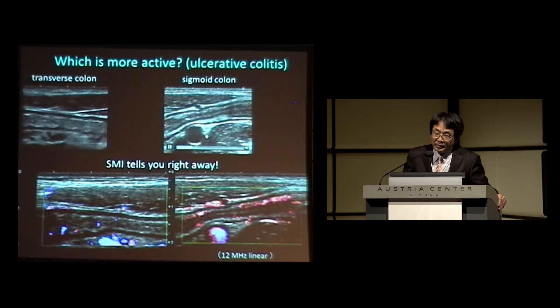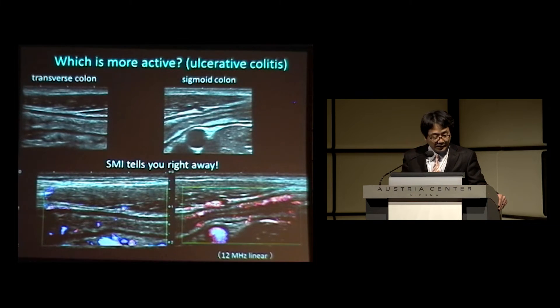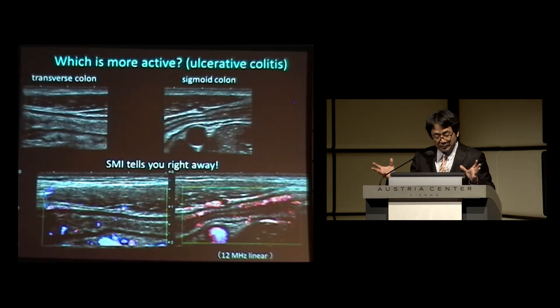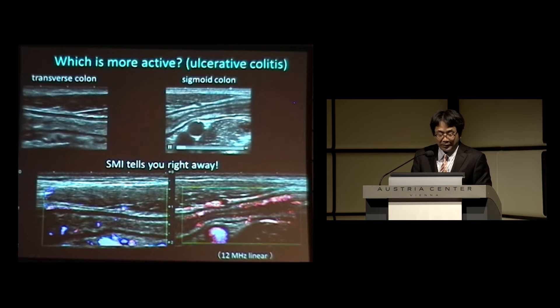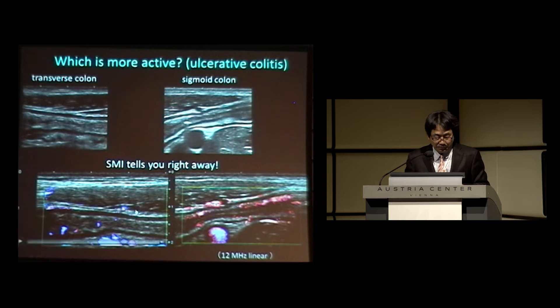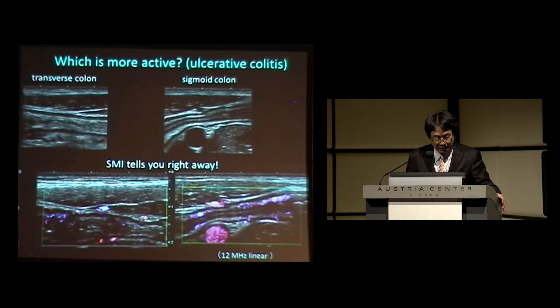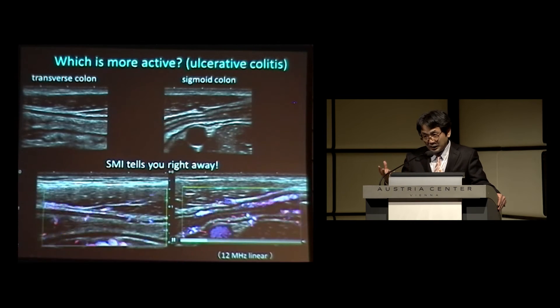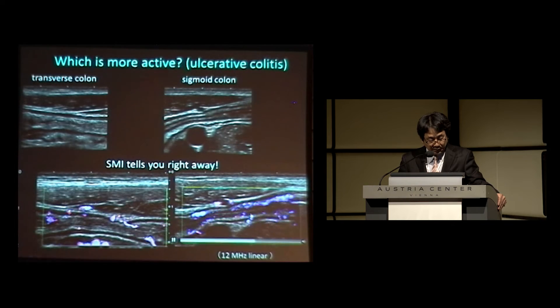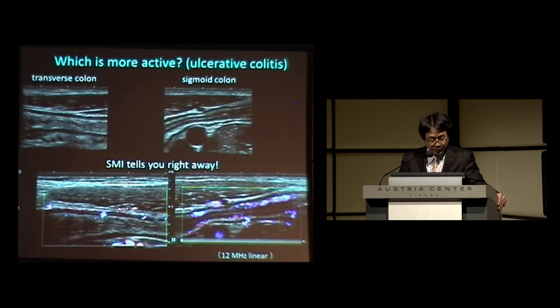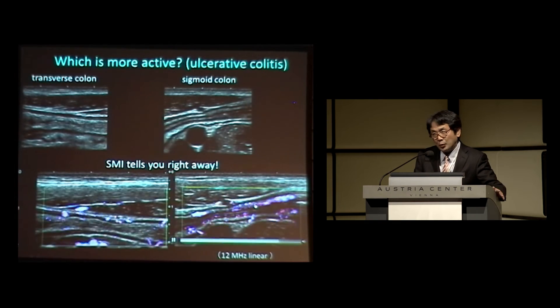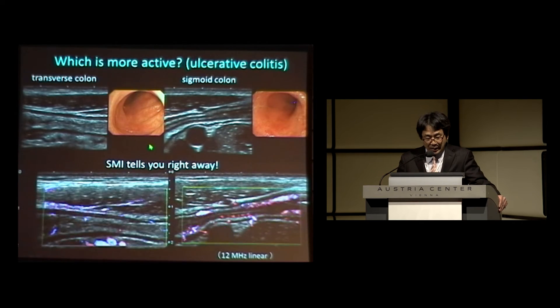Using SMI for the gastrointestinal tract is another good option. These pictures are from a patient with ulcerative colitis. On grayscale, you can't be sure which bowel segment is more active, because the wall thickness is about the same. But using SMI, it is obvious the sigmoid colon is more hyperemic than the transverse colon. You can even detect increased blood flow in the mucosal layer — this anterior wall, posterior wall, and the black belt representing the mucosal layer. This was confirmed by endoscopy.